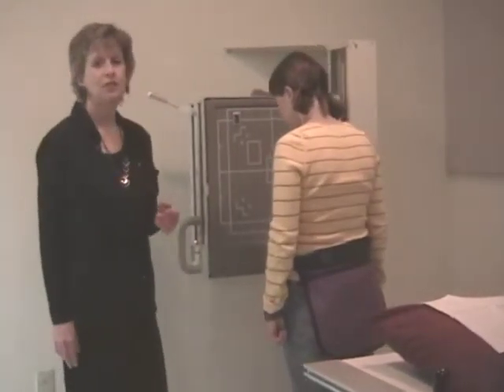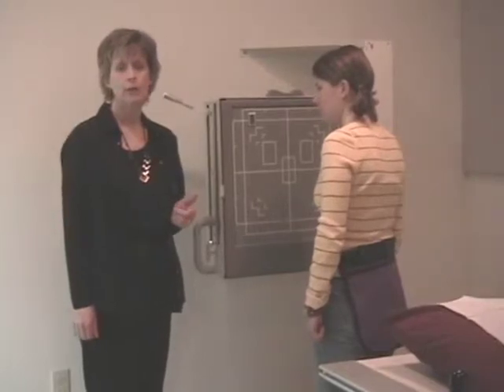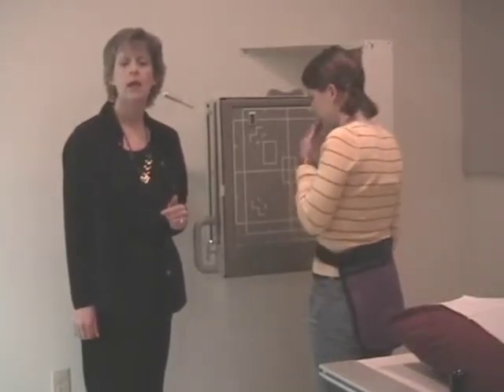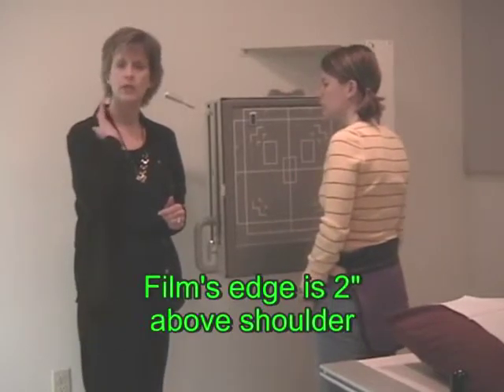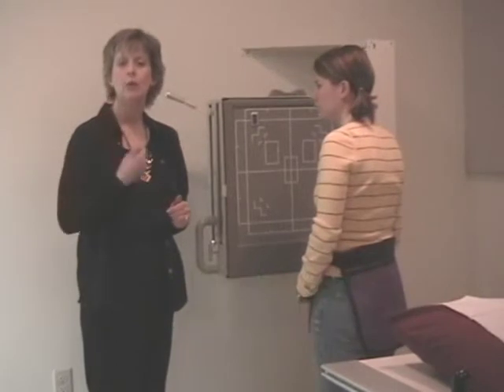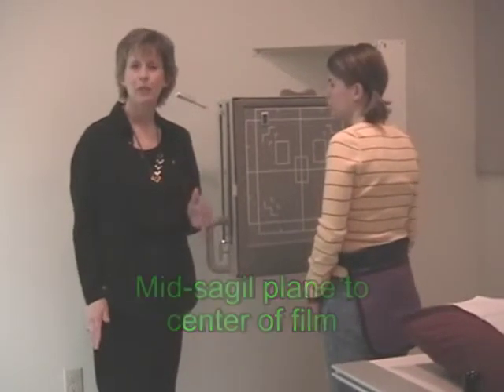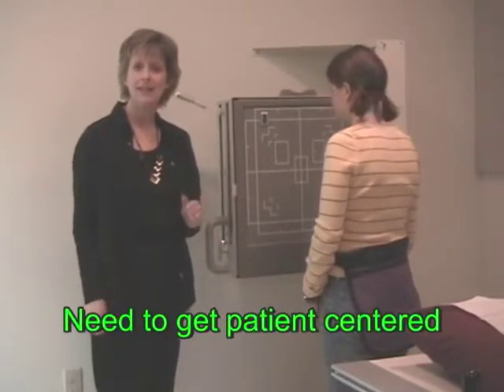Now we need to position the patient. You will recall part film reference points. We're going to do the PA projection first. And the part film reference points are: the film's edge is 2 inches above the shoulder with the mid-sagittal plane to the center of the film. We need to get our patient centered. That's what part film reference points are. Get the anatomy centered to the field of view.